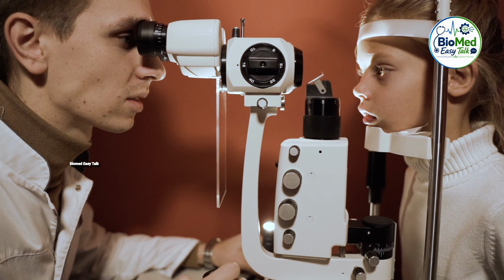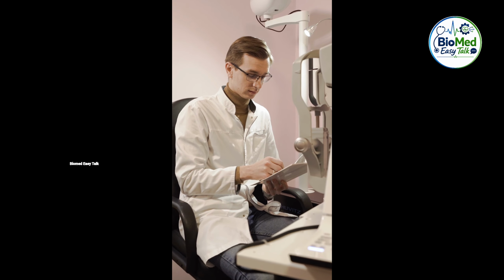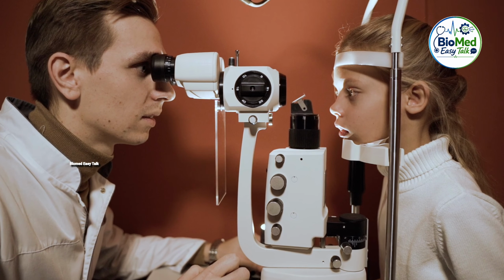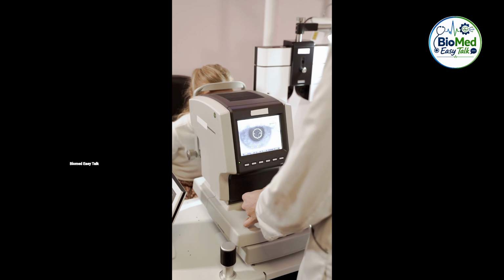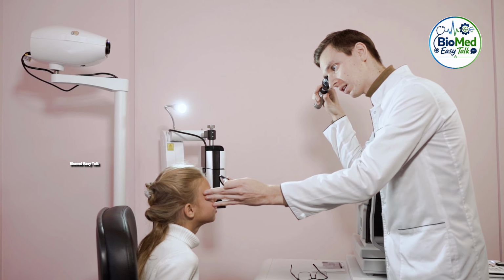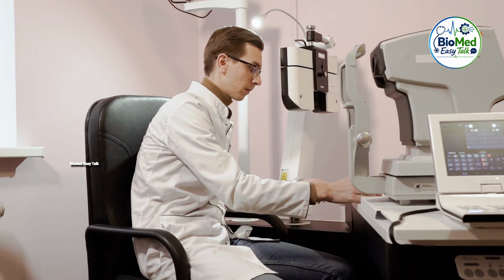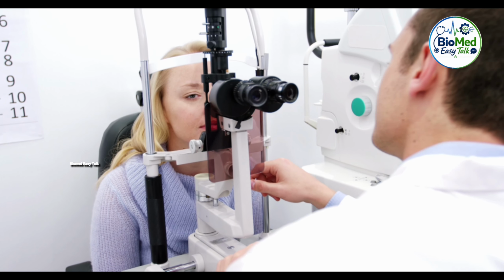Types of slit lamp microscope: Haag-Streit slit lamp, light source is above the microscope. Zeiss type, light source is below the microscope. Tabletop stationary slit lamp, fixed in clinic with chin rest. Portable handheld slit lamp, small, battery operated, used anywhere. Digital slit lamp, has camera for images and videos. Surgical slit lamp, used during eye surgeries for magnified view.